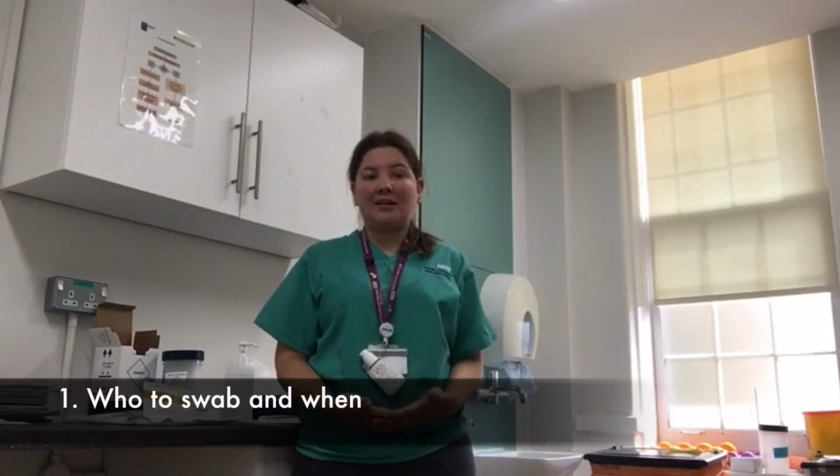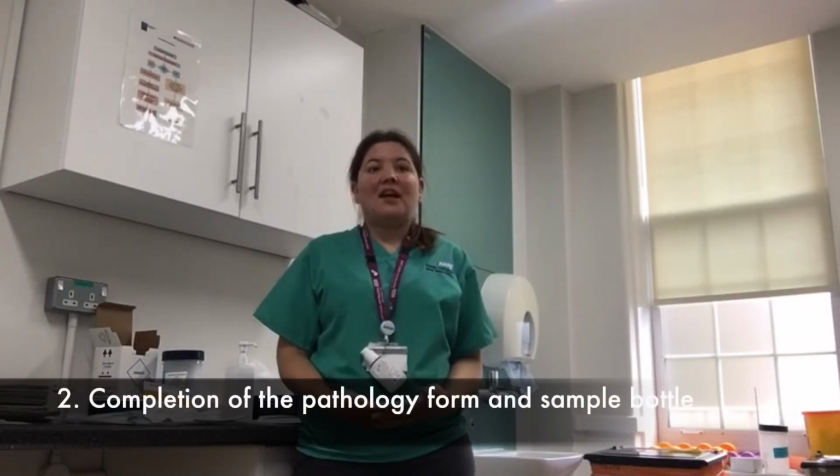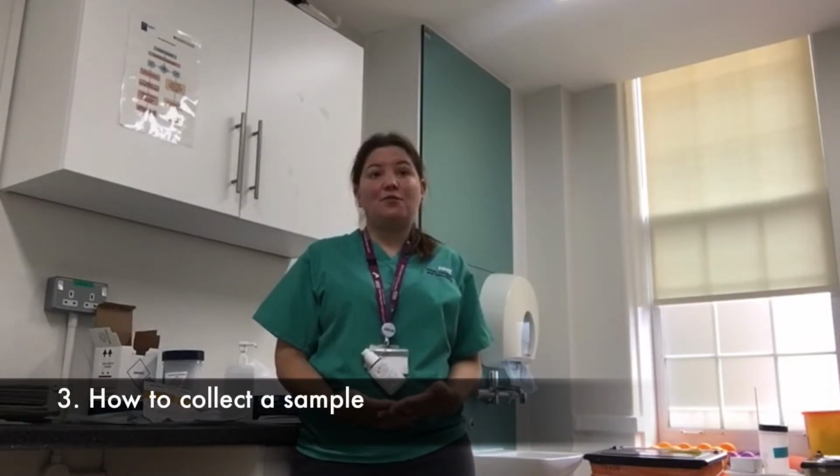In this short video, I aim to demonstrate the process of collecting a nose and throat sample for COVID-19. This will include information about: 1. Who to swab and when. 2. Completion of the pathology form and sample bottle. 3. How to collect a sample, including the process for putting on and removing PPE, and correctly packaging the sample for transport.